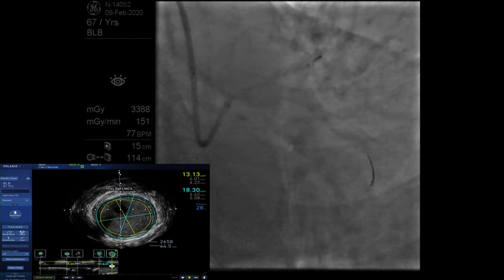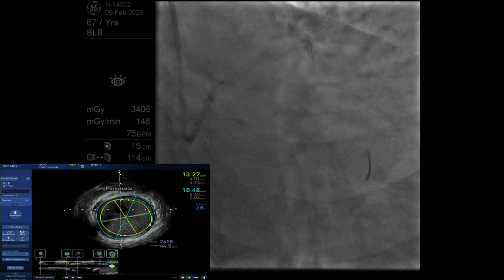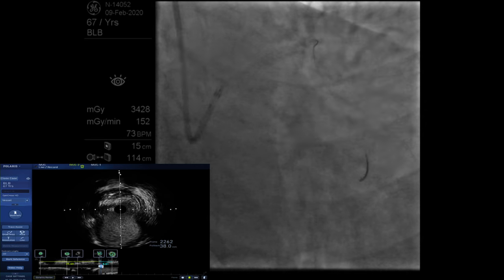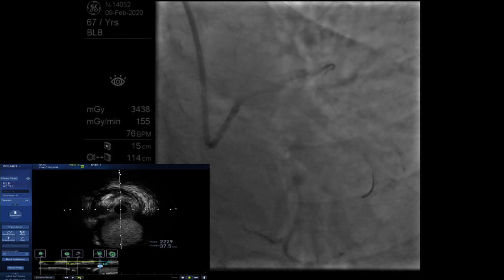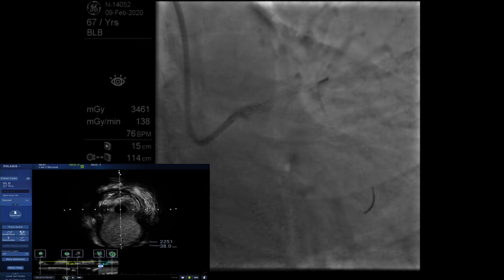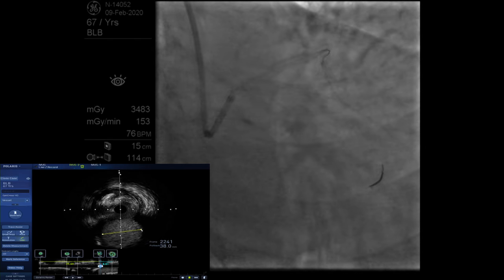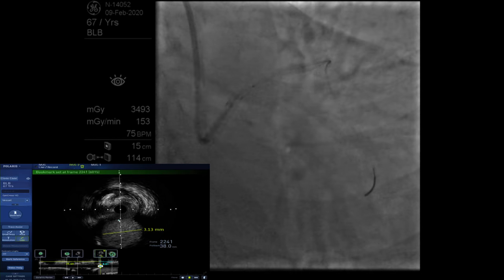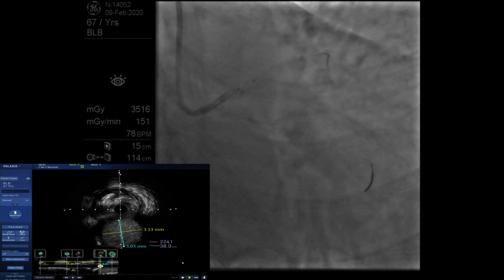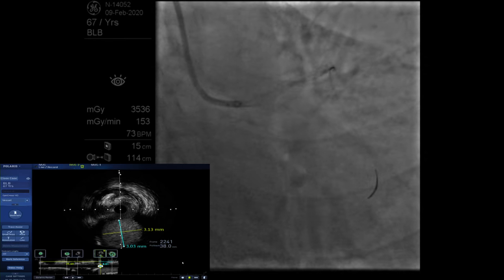Dr. Akasaka? Yes. Are you using the same criteria for OCT and IVUS about side branch closure? This one, the circumflex looks very healthy. Yes. And looks like more than 1.7 millimeter. Definitely. Is it the same criteria, or you don't have the data for that? There are no data about IVUS, but we can apply similar data based on OCT. So you can measure the lengths, and then we try to check the tip angle. But there is no IVUS data showing side branch occlusion. But from what you look at, you think the risk for side branch closure is very low. But the length of the vessel is huge, and there is some carina shift making some stenosis, but it might be okay.